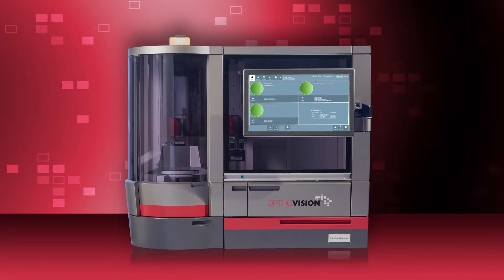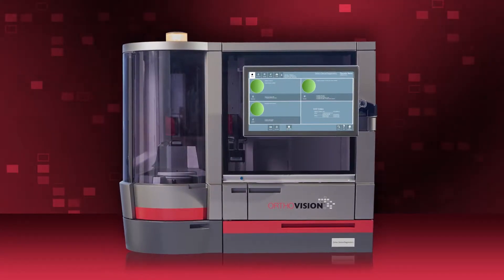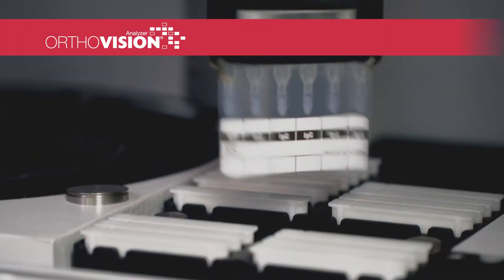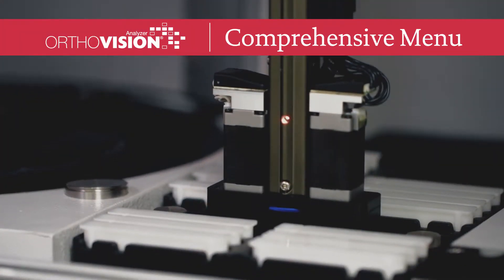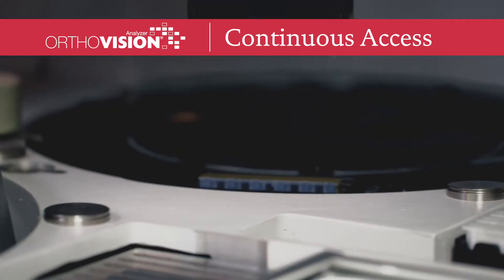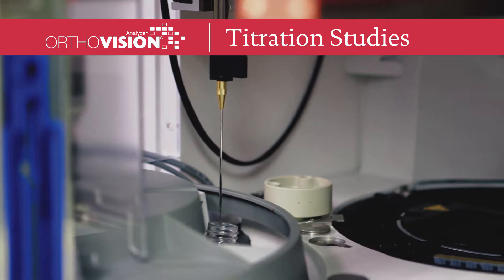Introducing the OrthoVision Analyzer, designed to help you take efficiency to the next level and say goodbye to the trade-offs and compromises that have typically delayed results. With the most comprehensive testing capabilities on the market, OrthoVision goes beyond types and screens by automating and standardizing the full range of immunohematology testing.